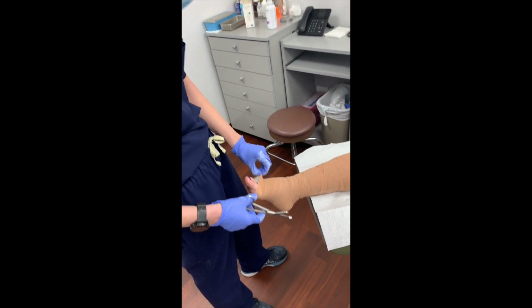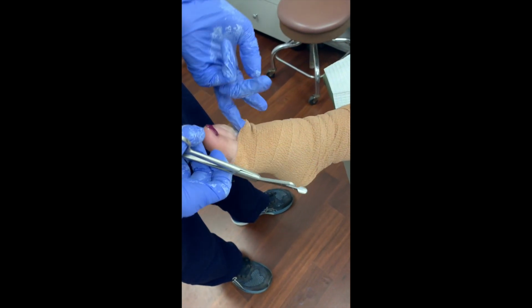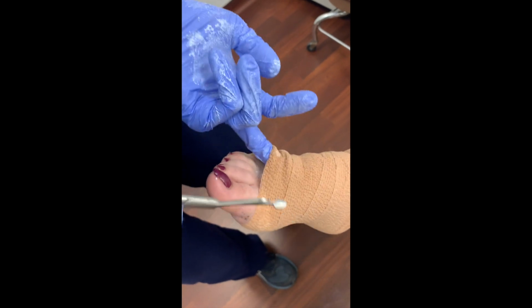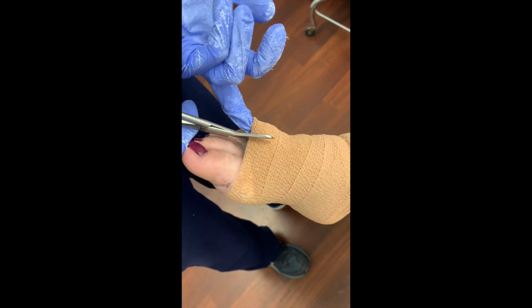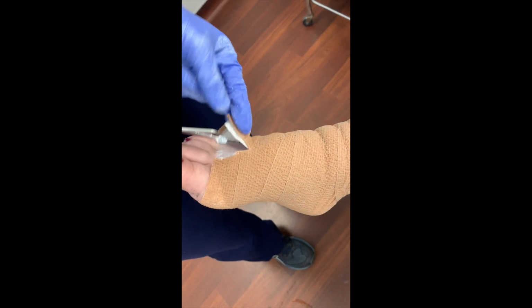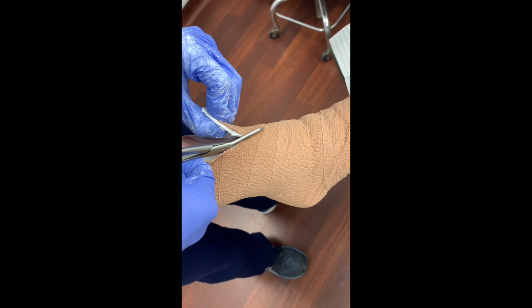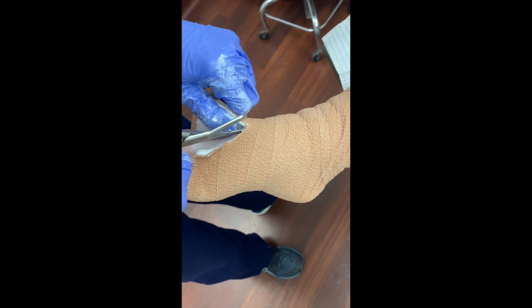An easy way to take this off is just layer by layer. You can get your finger underneath. Make sure that you're not cutting the skin, so basically just follow and pull up as you go. Check in with the patient. Do you feel any tenderness or impingement?